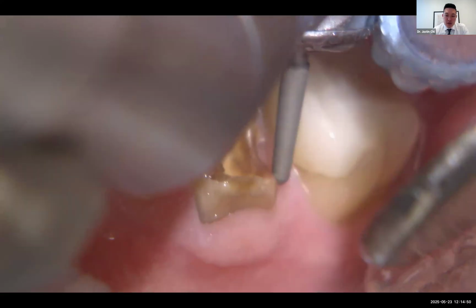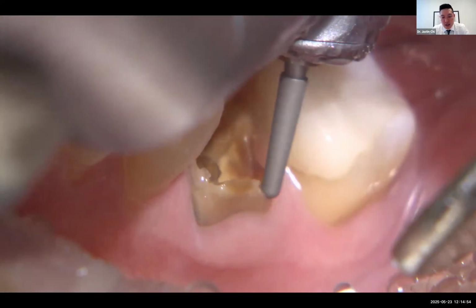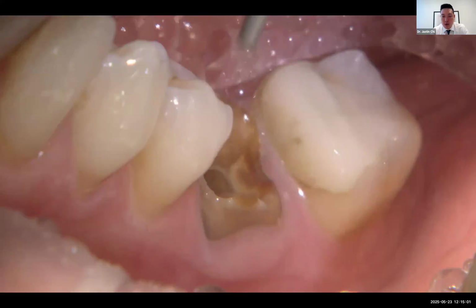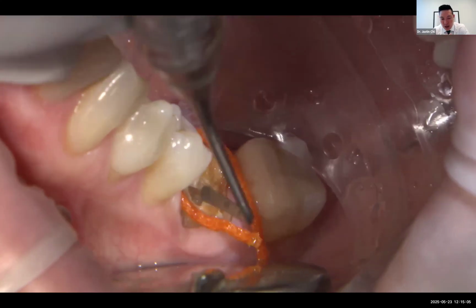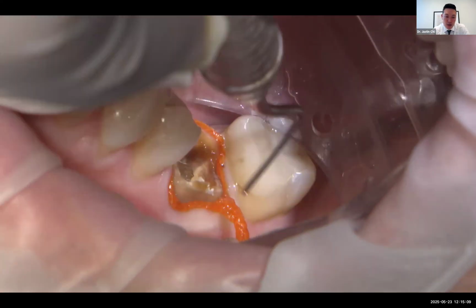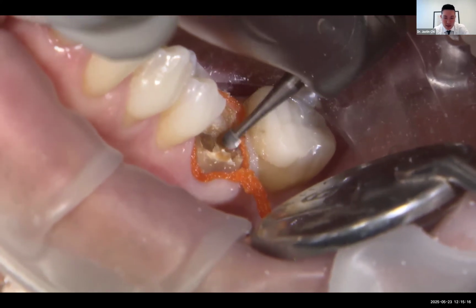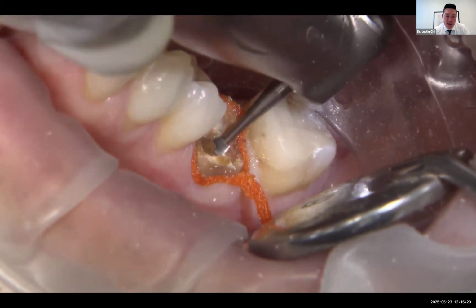So through the preparation, we're always using round-ended tapered diamonds in our clinic. That allows for where the tip of the burr comes into contact with the tooth structure, at least those zones are rounded. Here, these extensions coming upwards, you have to be a little bit creative, maybe turn the burr sideways, or maybe a football burr, round burr can work really well through this zone. Here, the margins are kind of equigingival, getting to subgingival. Go ahead and pack a size 2 cord in, let that sit.